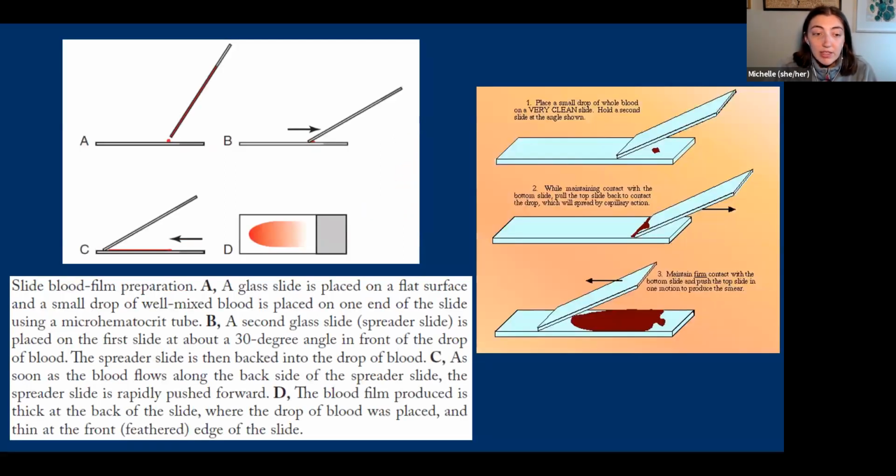And then I have a couple slides in here about making a blood smear. I'm going to do a separate post on how to make a blood smear, but this is just some tips. Generally in the hospital, you're not going to need to be making blood smears. We'll make them from the EDTA. But if for some reason you only get a drop of blood and you want to make a smear, there are some tips here on how to make a blood smear.